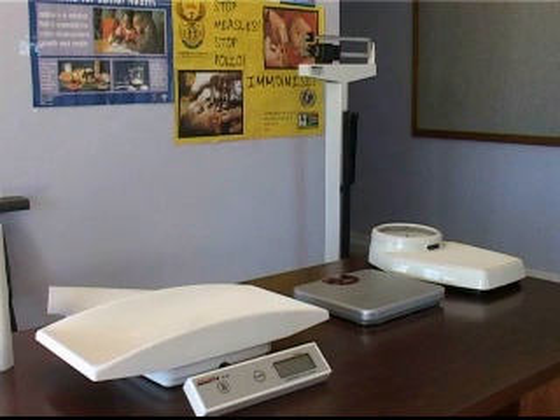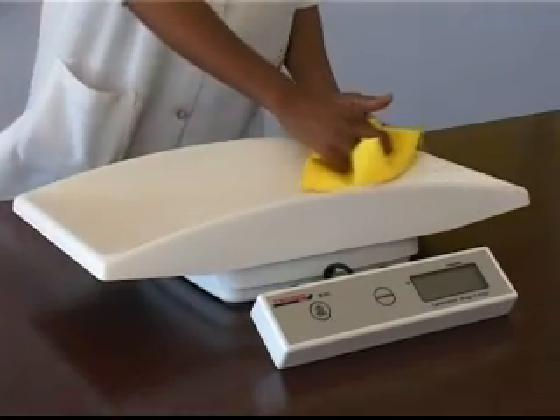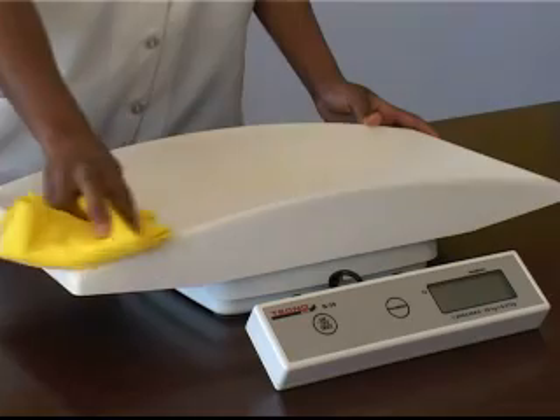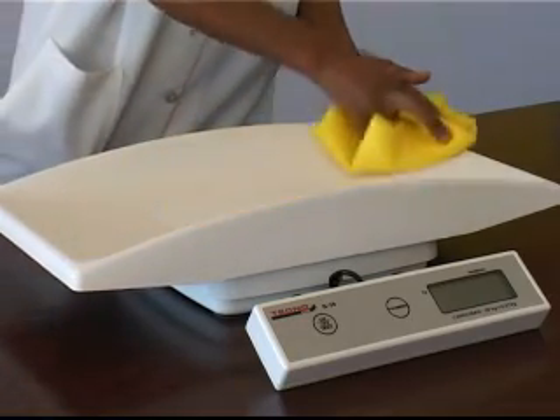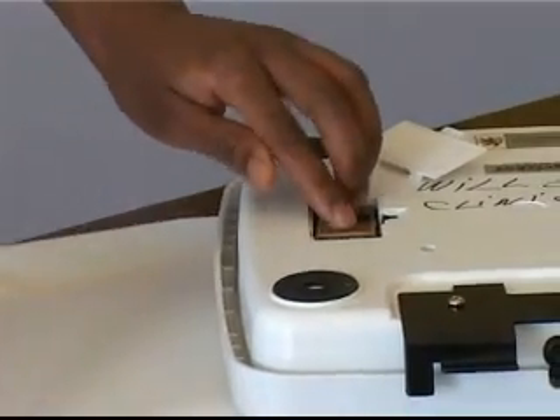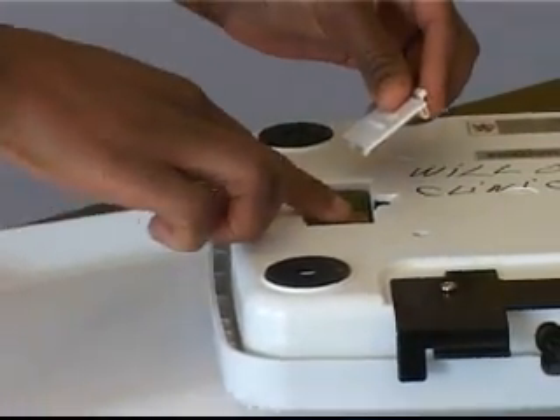Weighing scales can be easily maintained by the user. The main points for maintenance are: Cleaning — it is important that weighing scales are kept clean and are kept in a clean environment to avoid damage by insects, in particular cockroaches. Changing the battery — if the weighing scale operates on battery power, make sure that the battery is replaced timelously.